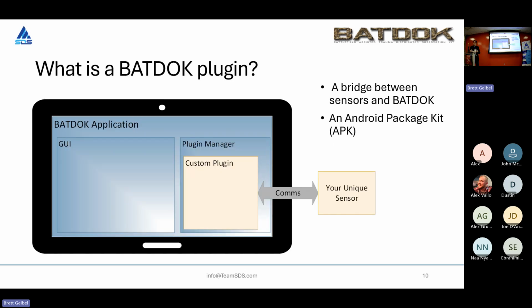So I've been throwing this term, plugin, around a lot recently, and basically what a BATDOK plugin is, ultimately, is a bridge between your BATDOK application that the medical providers are very familiar with and the sensor that will be passing its live vital data directly into BATDOK. It is also what we call an Android package kit, also known as an APK.